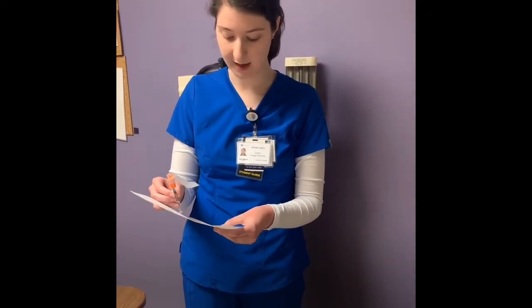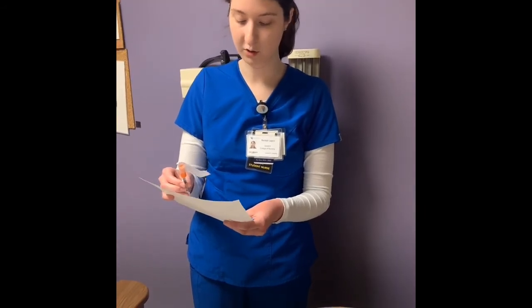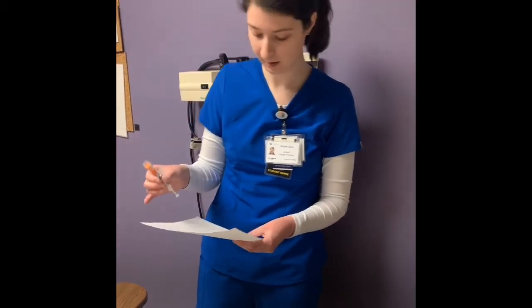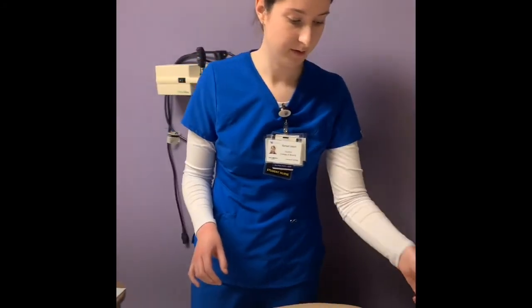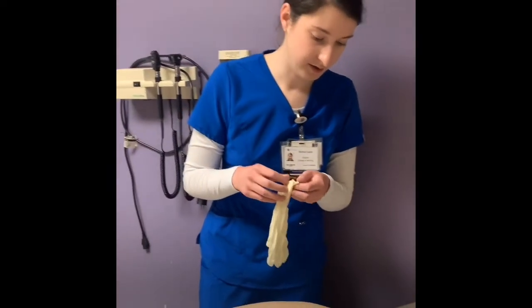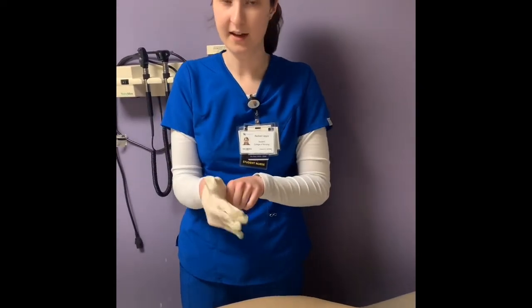According to the sliding scale of insulin and the patient's current fingerstick blood sugar levels, I am to deliver 20 units of regular insulin, and I have prepared 20 units of insulin here. It is currently 1100, which is when this is prepared to be delivered. Okay, so I will be giving this injection in the lower right quadrant of the abdomen. Upon inspection of the patient's abdomen while I'm putting on my gloves, there is no bruising or redness or swelling and any indications of infection. So I should be safe to give it in this area.